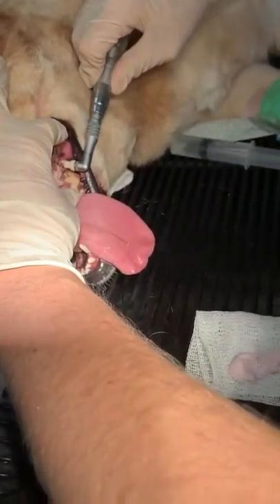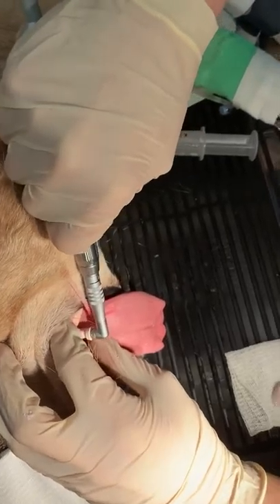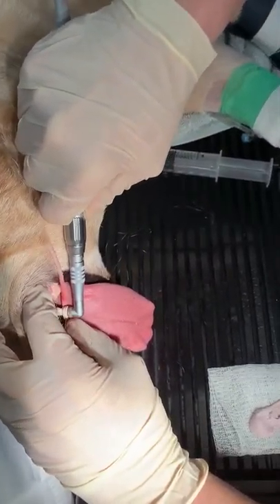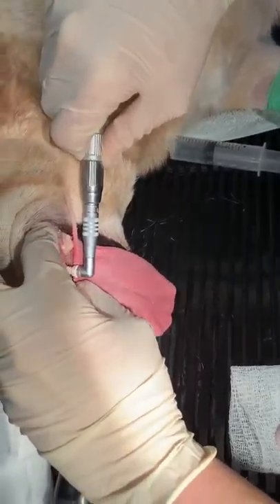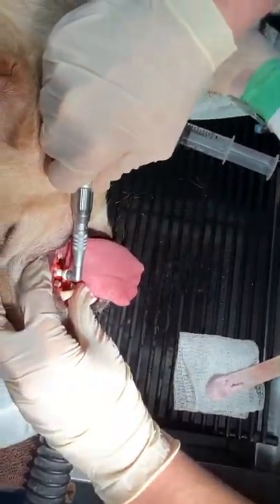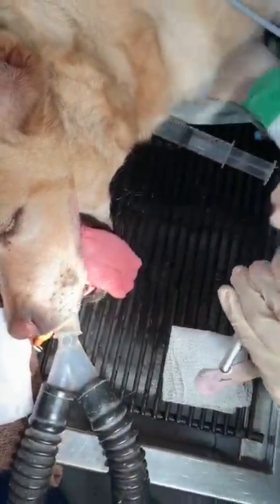The tricky thing about these polishers is you have to keep that rotating head away from their hair and away from the side of their lip, because it will catch hair in there like nobody's business. It's pretty hard on the dental polisher and pretty hard on their mouth hair.